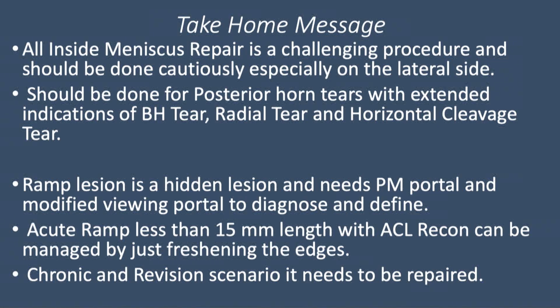So the take-home message is that the all-inside technique is very demanding, but a relatively easy procedure once we are habituated with it. But it is challenging, and considering all these, precautions should be taken because of the limited space there in the lateral compartment.